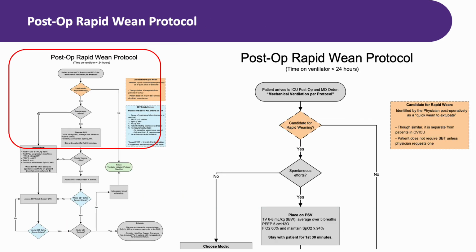Alright, we are now shifting to a very different population and a very different pace. This is the post-op rapid wean protocol, and as the name suggests, the goal here is an accelerated pathway to extubation for post-surgical patients. Let me set the context.